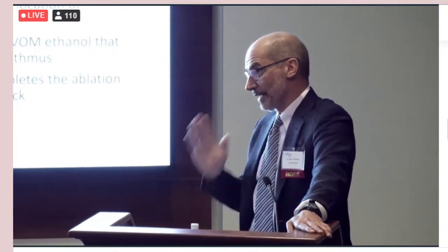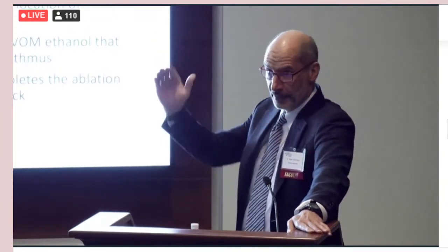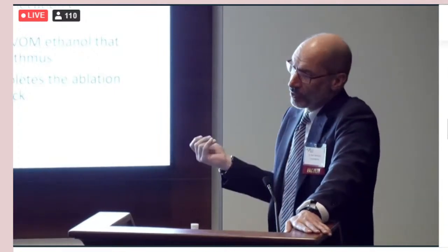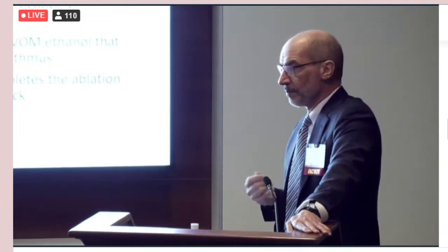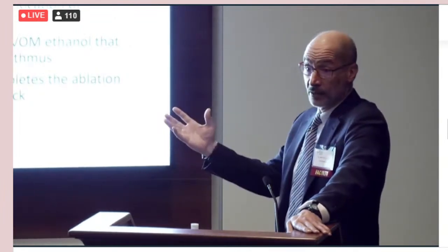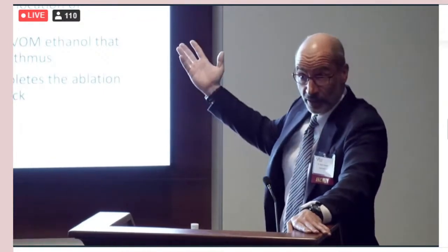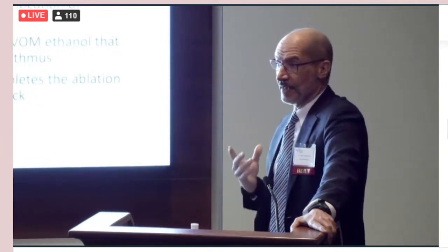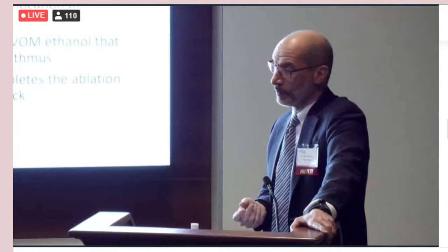So specifically, I get the balloon as distal as I can advance it in the vein of Marshall, and I'll do 1 cc there. You inject contrast ahead of the alcohol because you will see some patients will have collaterals, so capillary venous collaterals to roof veins, sometimes extracardiac collaterals too, and you want to see before and after. Typically, I give the alcohol over 2 minutes, 1 cc over 2 minutes.